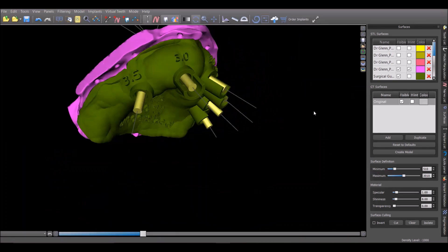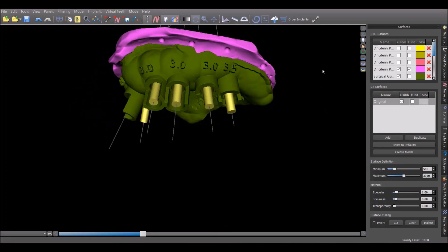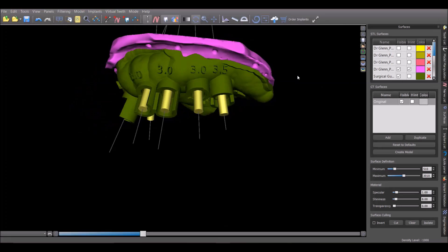Here's the guide. I've got a Juul 3D printer in office, so I went ahead and printed it — though you could also outsource that without any problem. All of the osteotomies are planned to be one size smaller than what I actually intend to place, so that I can expand up with rotary expanders during surgery. So let's go to the surgery now.